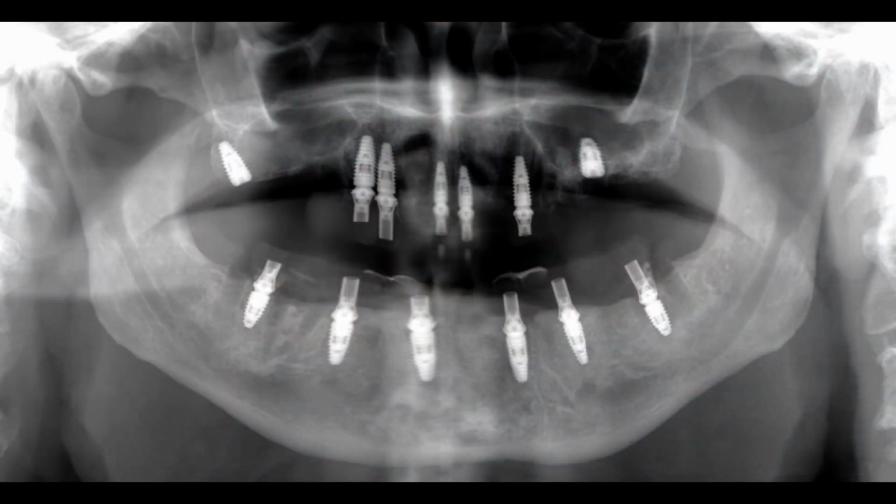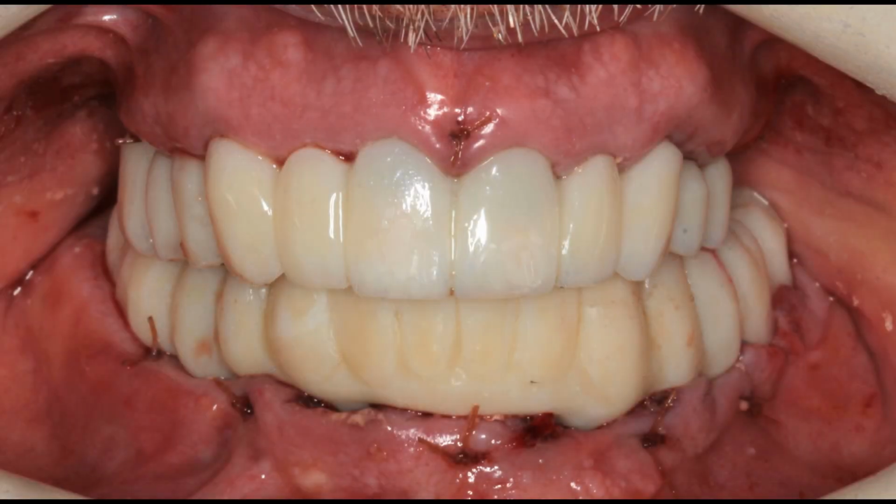Here he is on his day of surgery. Not all of his implants were stable enough to use for the temporary, but enough were stable that we could give him nice upper and lower fixed temporaries. Here's the temporaries on the day of surgery.